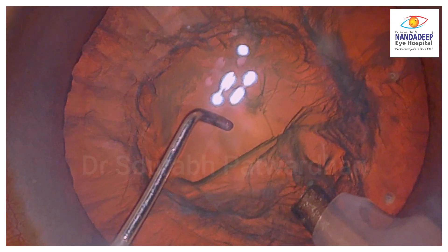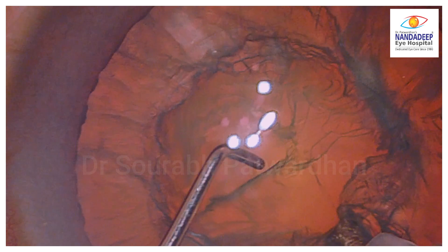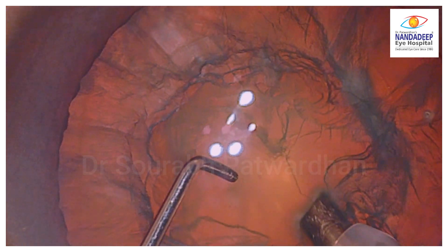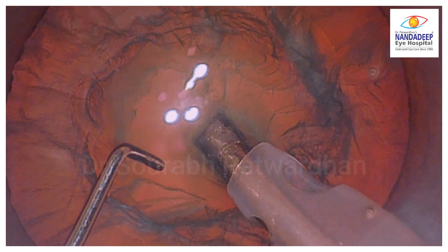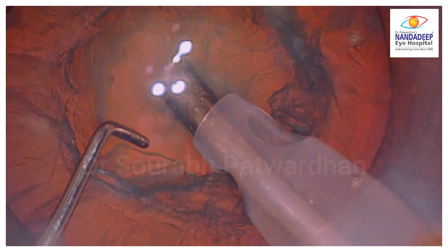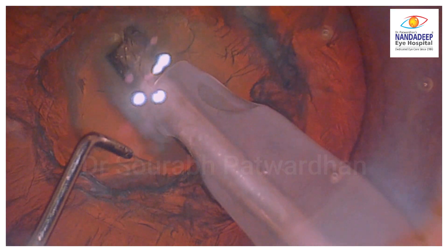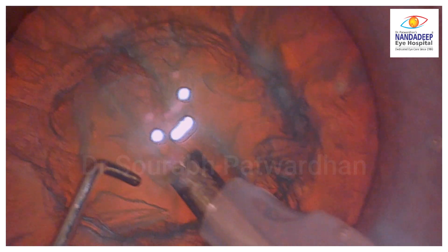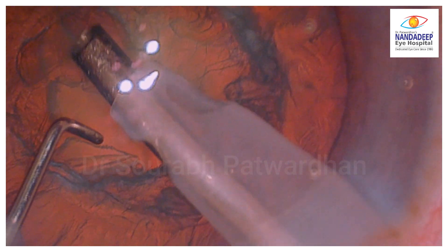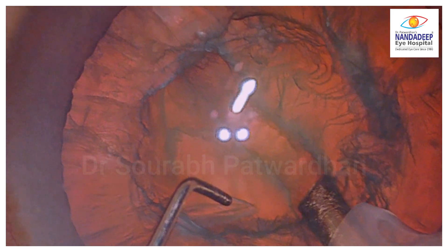There should be no pushing of the nucleus, and you can appreciate the emulsification of the matter much more clearly when you slow it down and use high magnification to watch it. During surgery I would advise you to do this particular step at high magnification possible, but also record the video so you will be able to understand how the nuclear matter is getting emulsified. This will avoid mistakes such as going through the same trenched area again and again without any emulsification going on.